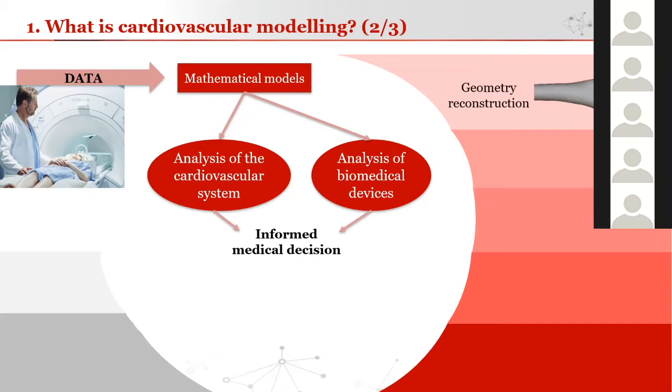So how are these models built? The first step is to create the geometry. This can be a patient-specific geometry, as I said, or it can be built using appropriate software. Here we see an example of a patient-specific geometry from a vessel, which was built from medical scans.